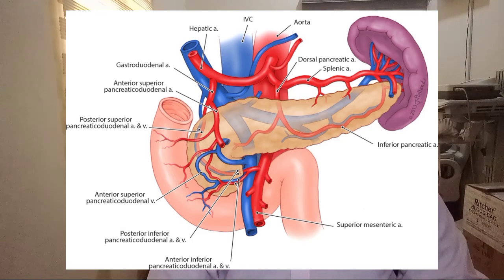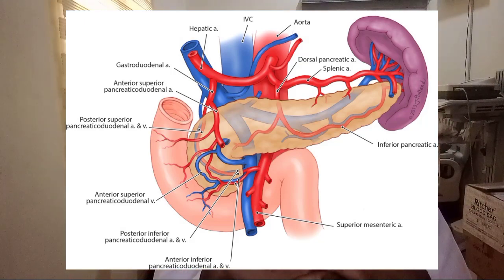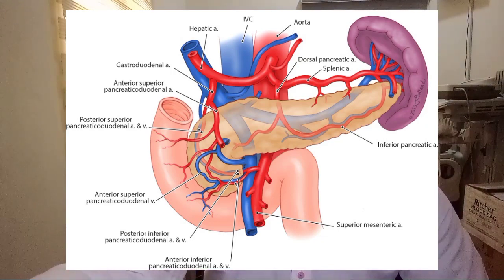The superior mesenteric vein ascends from the lower abdomen parallel and to the right of the superior mesenteric artery, and it joins with the splenic vein to form the portal vein, as a portal confluence, just anterior to the uncinate process of the pancreatic head and posterior to the neck of the pancreas.